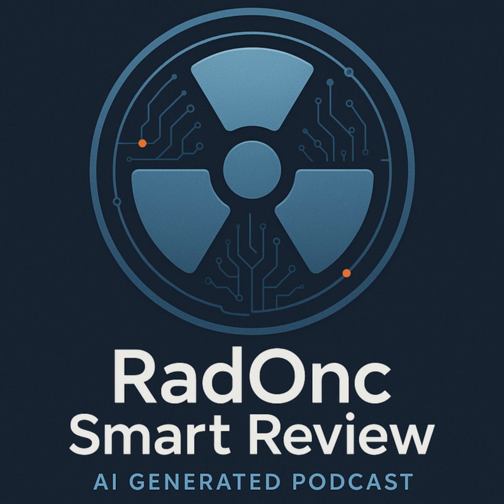Okay. Any other main options? The third big one is EPID dosimetry. EPID stands for Electronic Portal Imaging Device. That's the imager built into the LINAC head, right? Yeah. Used for patient positioning. Exactly. But with careful calibration and specialized software that models how the EPID responds to radiation, you can actually use it to measure the fluence or dose pattern delivered by the beam, either after passing through the phantom or sometimes even just in air. Using the built-in imager for QA. Yeah. That sounds efficient.